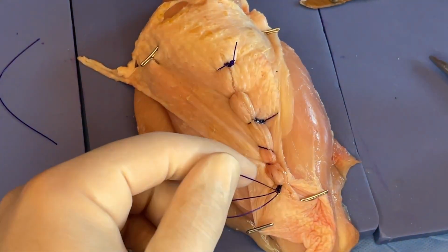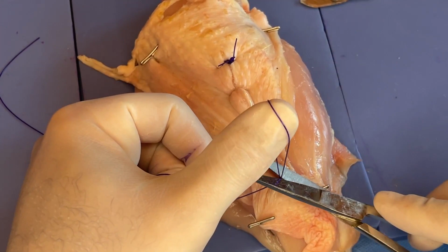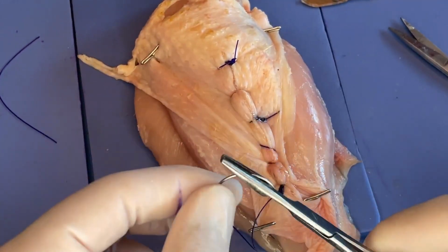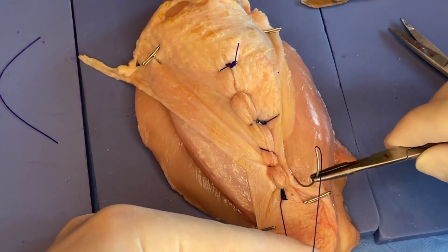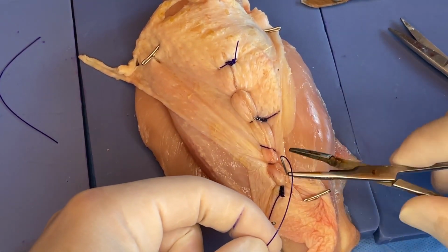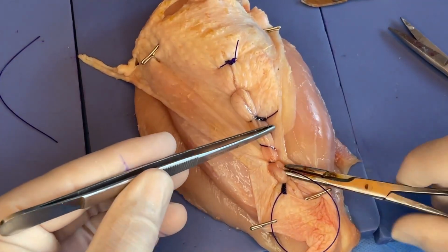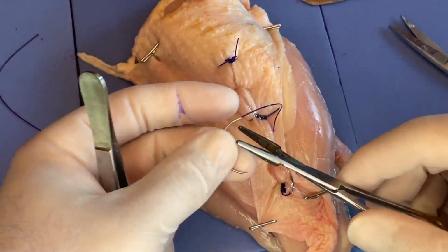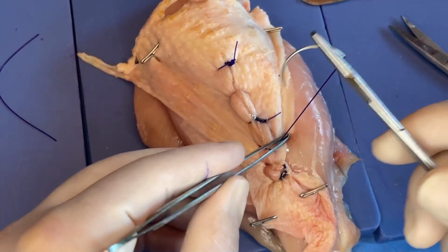All right, so there's our 4 complete, and you can see this knot's going to be sticking up above the tissue. So one thing that you can do is to cut the loop, and I'm cutting this fairly close to the knot, and now we've got this. So we're going to bury it. And the way that you can do this is I kind of backhand this, and I just travel kind of along the suture line, not going too deeply. And just doing one bite like this, you can usually get it so that it will kind of pull the knot under a little bit.